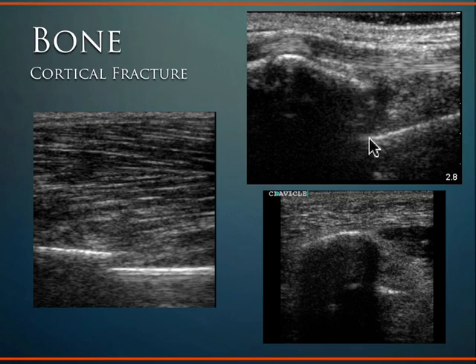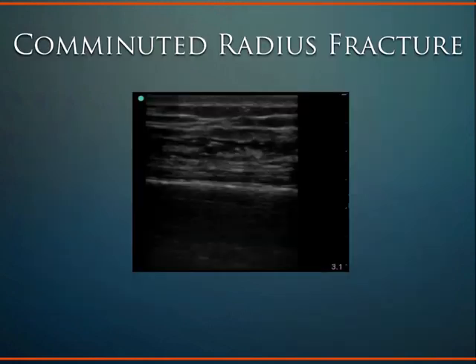It'd be nice if they were all this obvious. They're not always all that obvious when you're looking at that top right picture. And then this, distal clavicle fracture, very, very common step-off type appearance and displacement of the bony fragments.